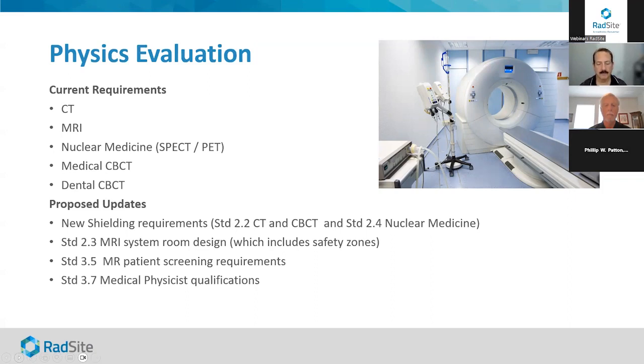Currently, we're in the process of updating our standards to account for some of the advances in each one of the modalities. As Eliot said, with MRI, they're going to super low field strengths, and they're doing post-processing, producing very good quality images. So how do we adapt for that? We're in the process of making some adjustments. But again, our standards for physics are in standard 7. It lists out all our requirements, what we look for, and what the pass-fail limits are.